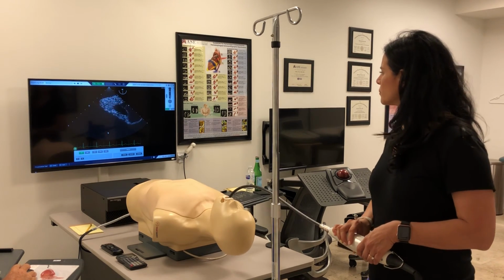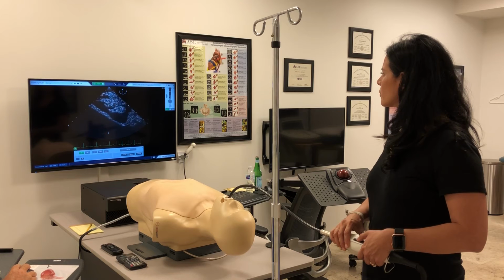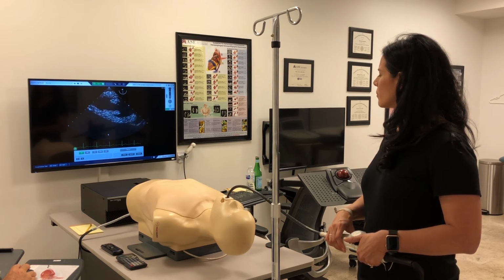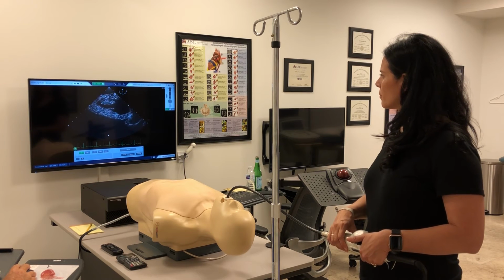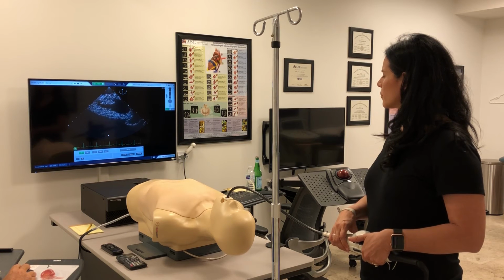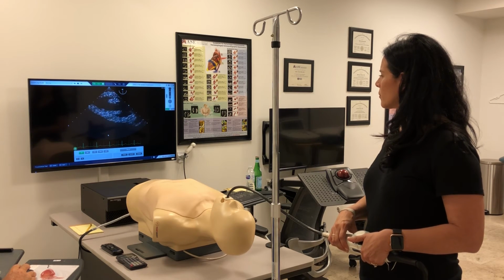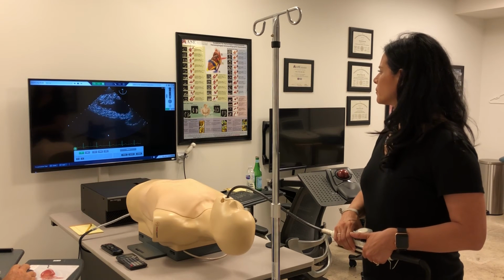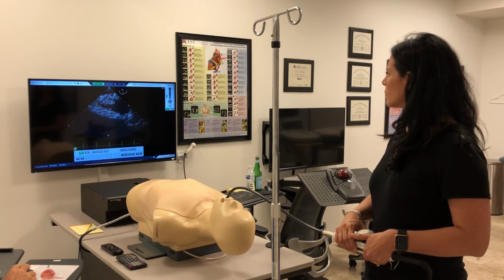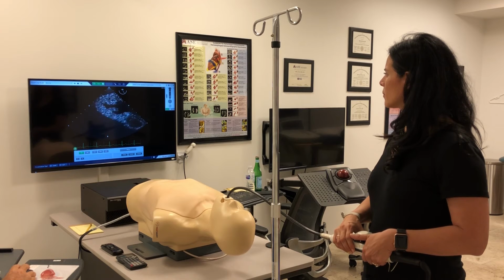Now let's go back to the two-chamber view to develop the subsequent view. Good. Now the next view is the transgastric long axis view. It is basically a Doppler view of the LVOT and the aortic valve. To develop that, you start with this two-chamber view and you slowly omniplane from 90 up to 120. And as soon as you start to think you see the aortic valve, LVOT and ascending aorta, be it on screen or off screen, you stop.